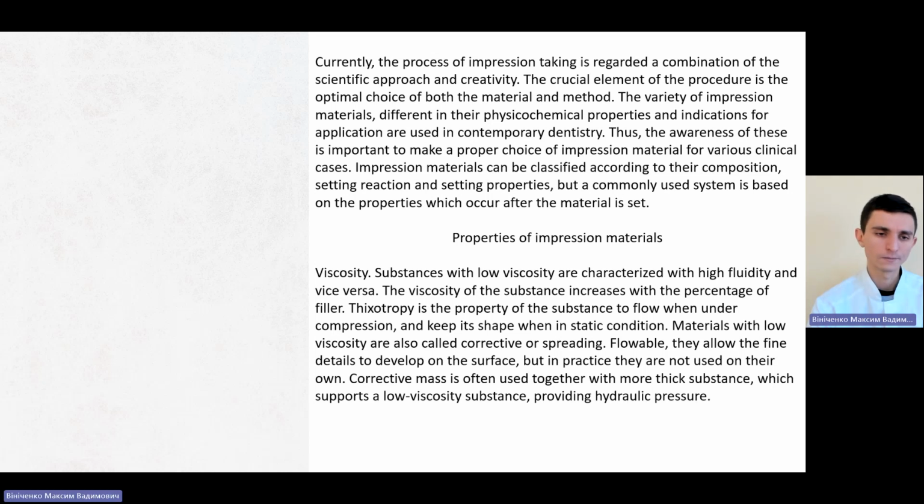Properties of impression materials. Viscosity. Substances with low viscosity are characterized by high fluidity and vice versa. The viscosity of the substance increases with the percentage of filler. Thixotropy is the property of the substance to flow when under compression and keep its shape when in static condition.